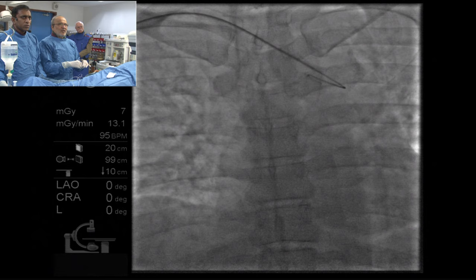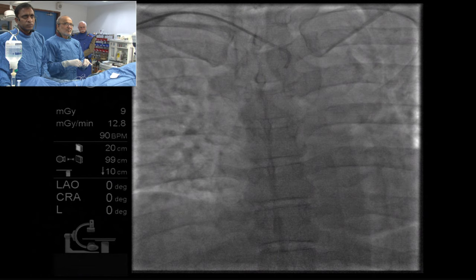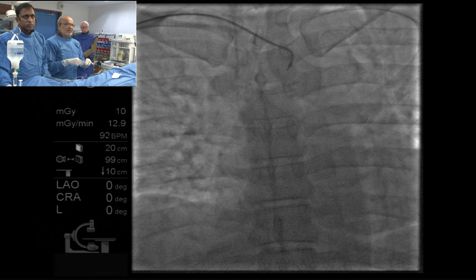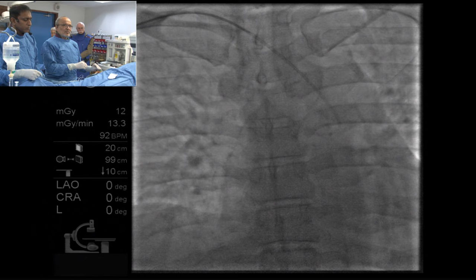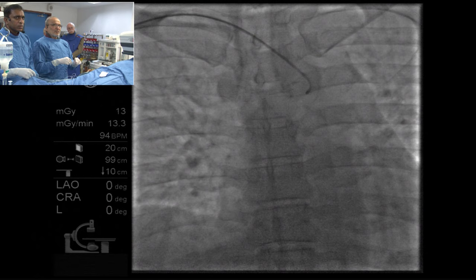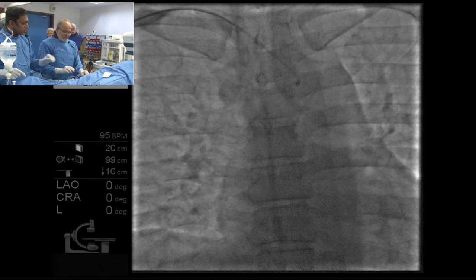See, this is a problem with this wire, the regular wire. So I will use a baby J. See? Baby J. Can you take it back a bit? It makes a U-turn there. Yeah. You saw that? Yes. Okay. Now we will take the baby J.